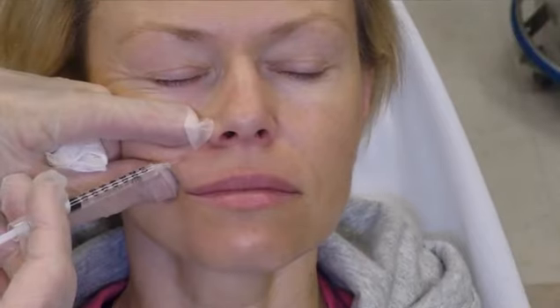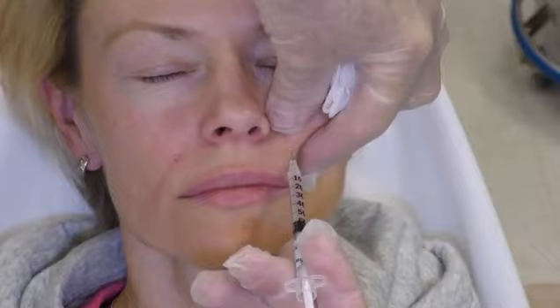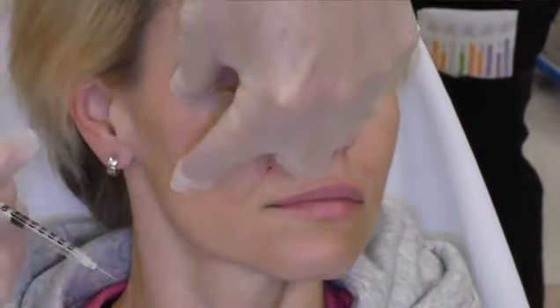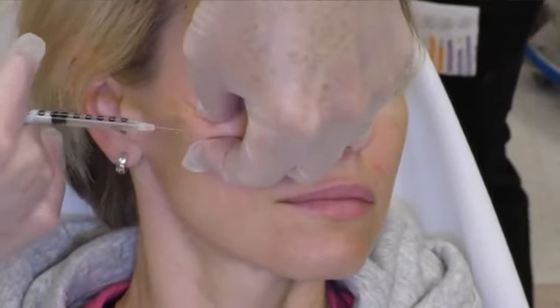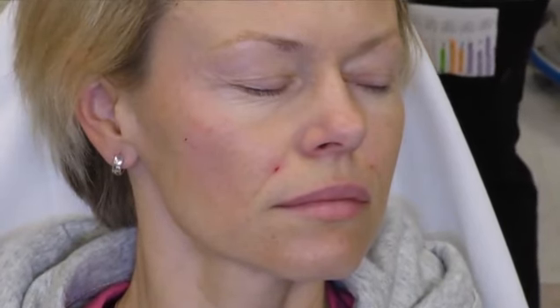To access the tear trough via cannula, either the premaxillary or peripiriform space, also known as Ristow's space, can be used. To gain access, ports are anesthetized in addition to a V2 branch block which was previously placed in this individual.